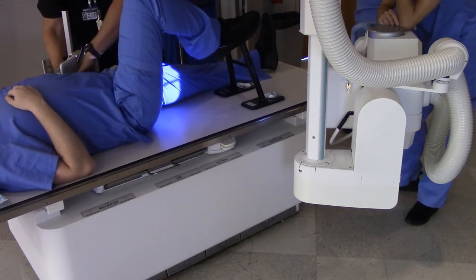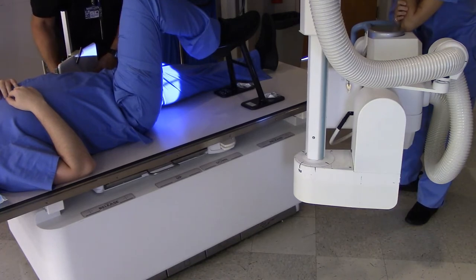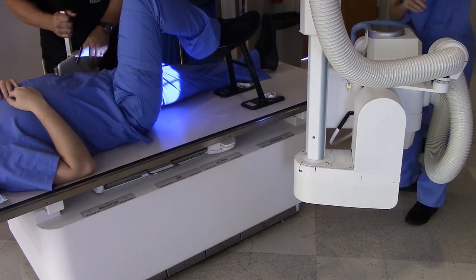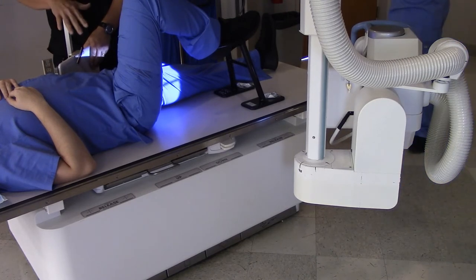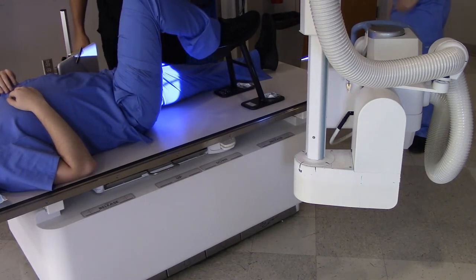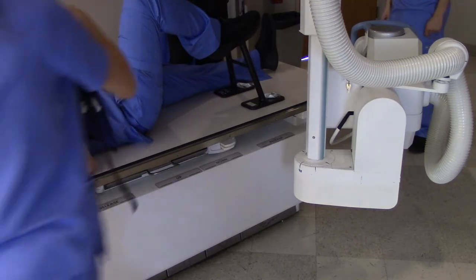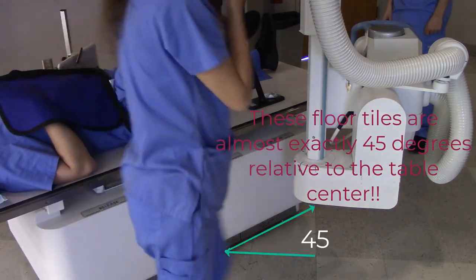We've got this image receptor basically right above the patient's crest — kind of like between the crest and the ribs. That's where we're going to go. And are we pretty well centered up? Yes, we are. This is actually better than what I had earlier. And her angulation is good because I can look at the floor tiles — the floor tiles are giving me a 45-degree angle.